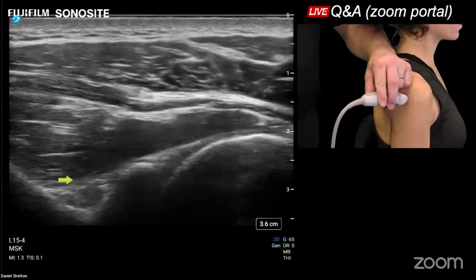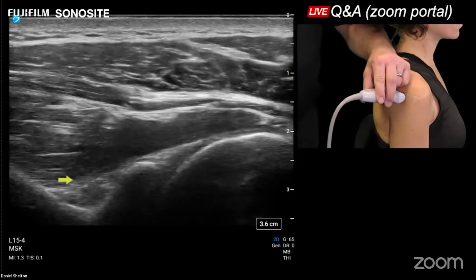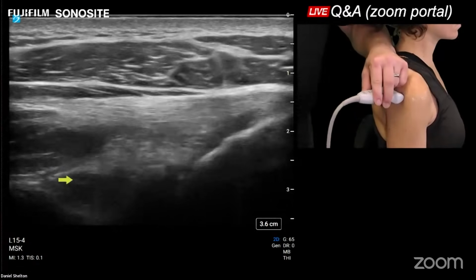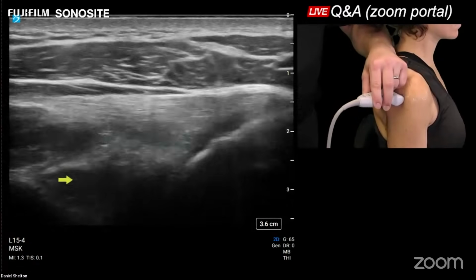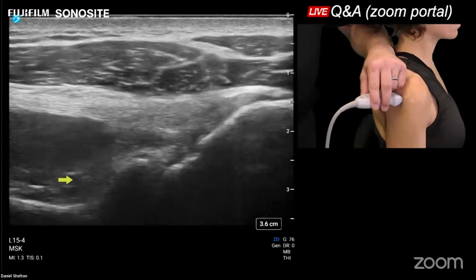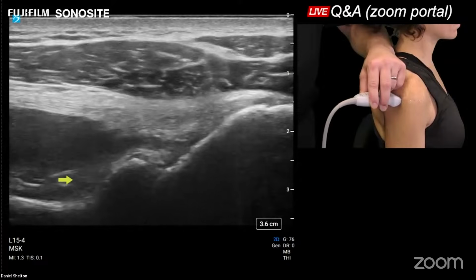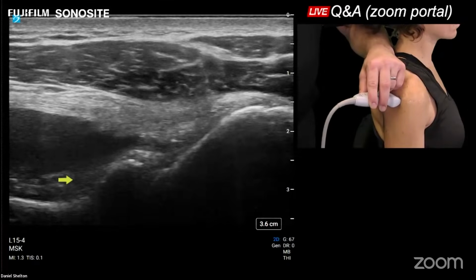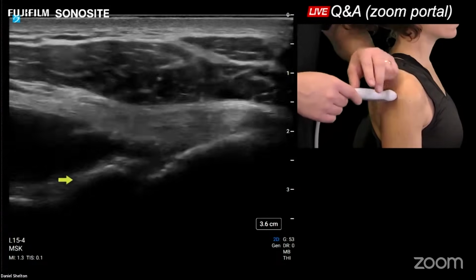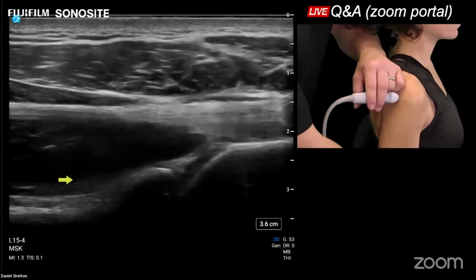And in the posterior shoulder webinar, we talked about dilating that vein and not calling that a cyst. So we're going to externally rotate the shoulder, and you see this big vein dilate right up in that notch. You just don't want to call that a spinoglenoid notch cyst, because a lot of those paralabral cysts will track down the spinoglenoid notch, causing entrapment on that suprascapular nerve posteriorly. So we're going to have our patient relax.